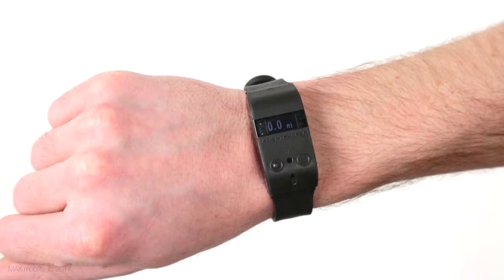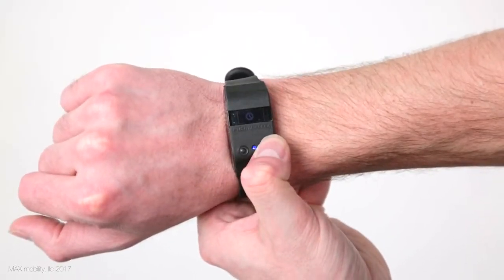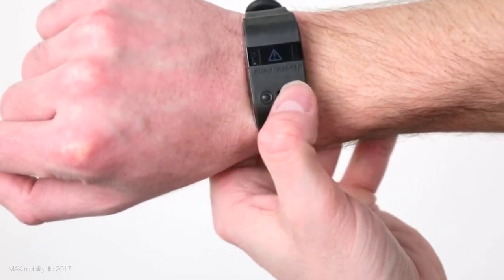To get into the settings menu, simply press and hold the right app connection button for 3 seconds. As mentioned before, this is where you go to manually set the time and other displays to your preferences. Another amazing feature is that through the PushTracker settings menu, you're able to customize the smart drive performance and operation if needed.